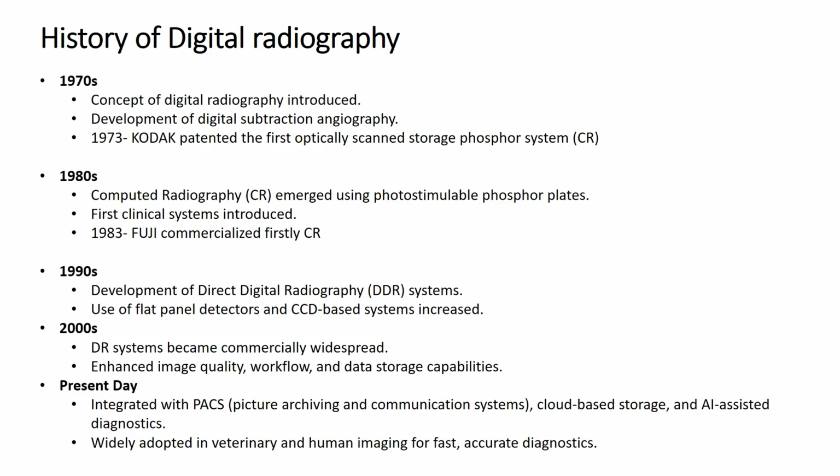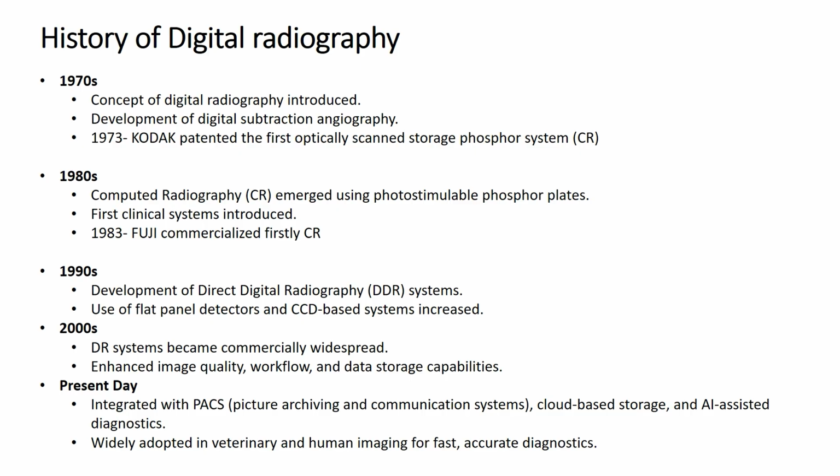Let us discuss the history of digital radiography. As you know, conventional radiography started in the early 1900s, but it has a very tedious procedure like processing of X-ray film, and many limitations are there.